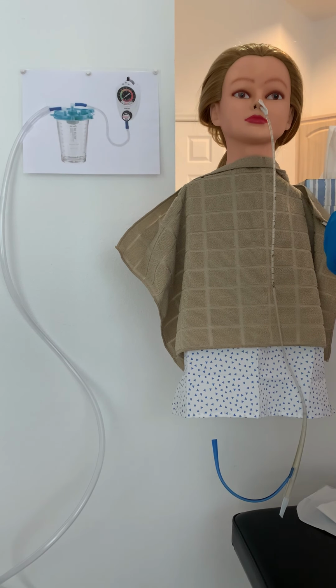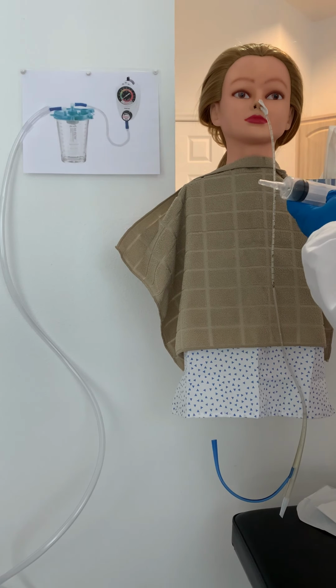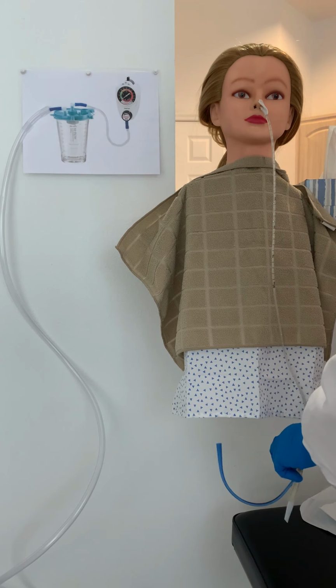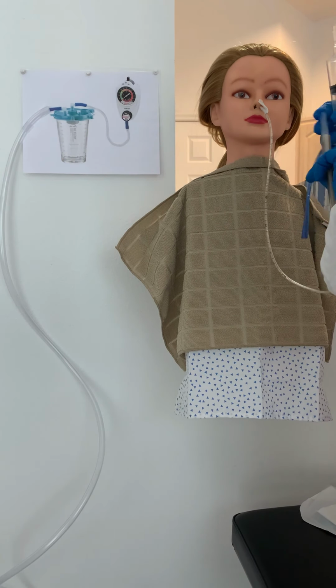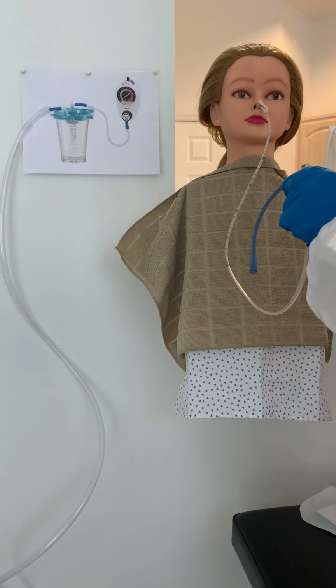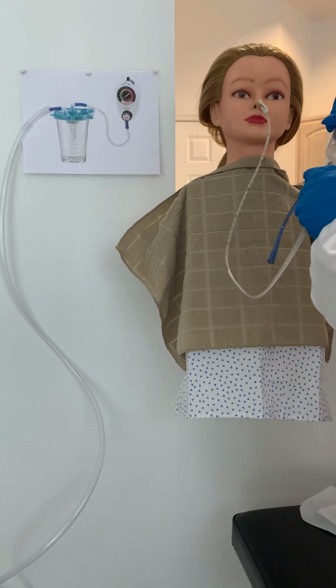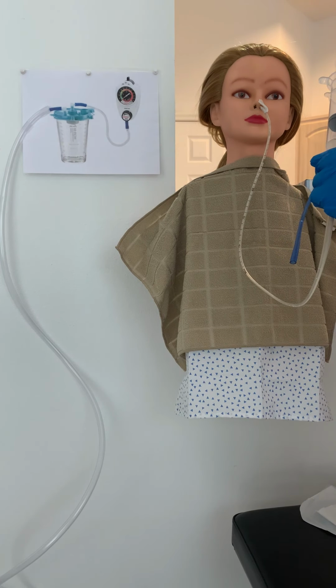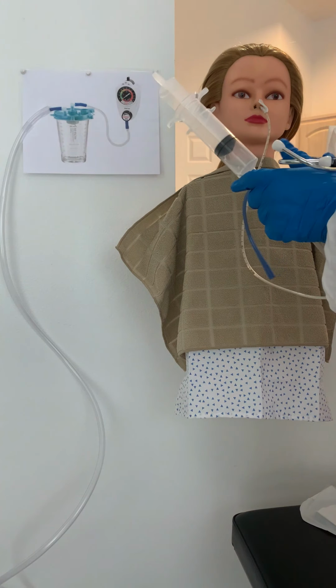Okay, now we're ready to check placement. So we want to take our syringe and we're going to put 30 milliliters of air. We can remove this connector piece temporarily. Don't lose it. And we'll plug our syringe in here. Then I'm going to get my stethoscope.